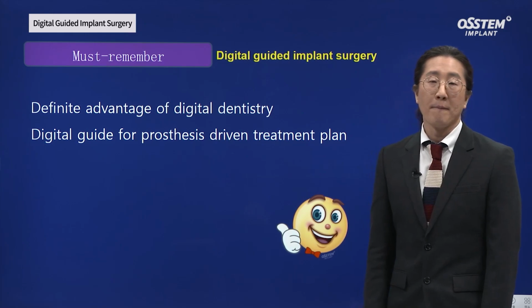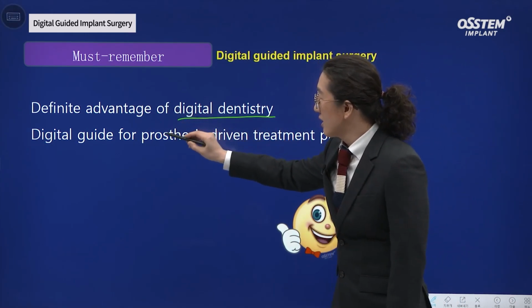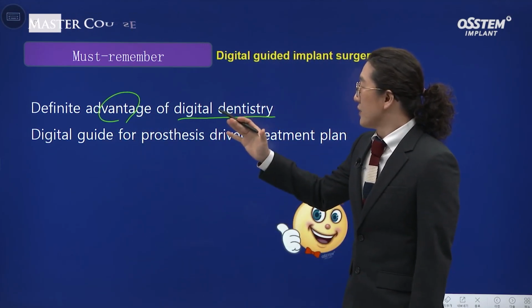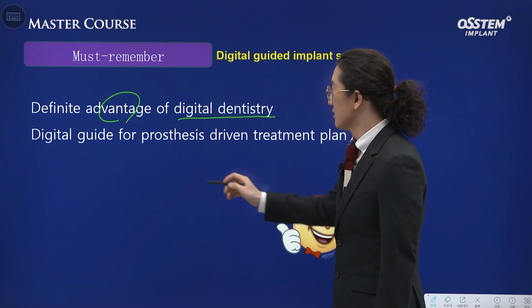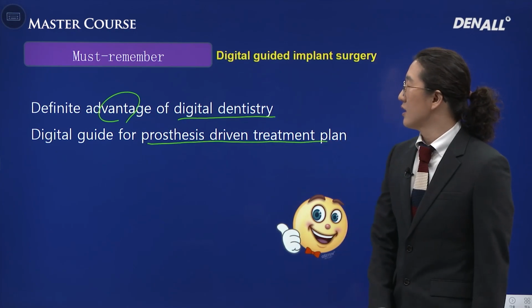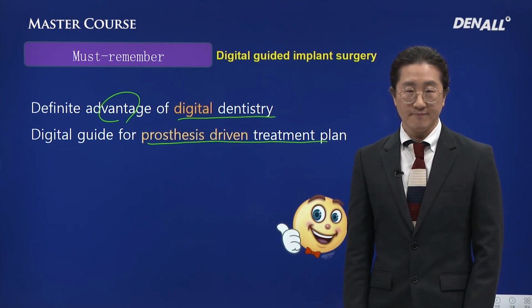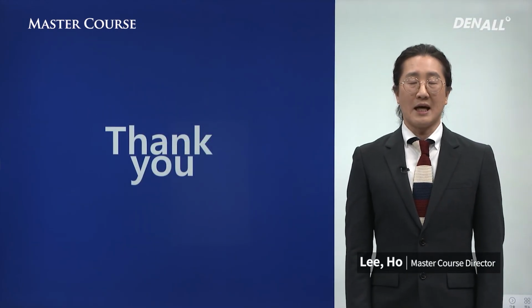Now I want to summarize. There are clear advantages to digital dentistry. The biggest benefit in doing digital guided implant surgery is that we can use top-down treatment plan or prosthesis-driven treatment plan. This is what I've prepared thus far.